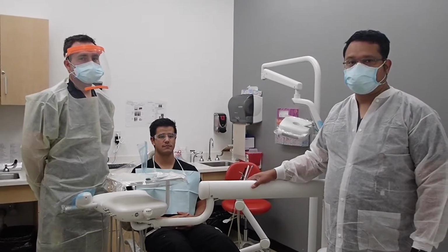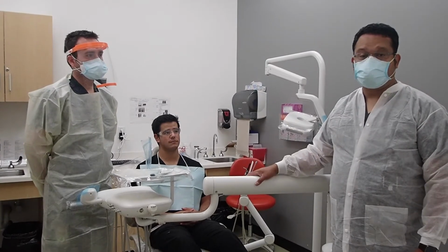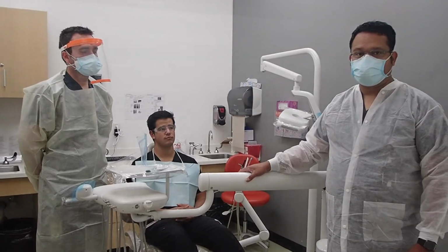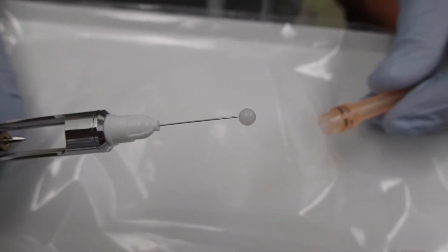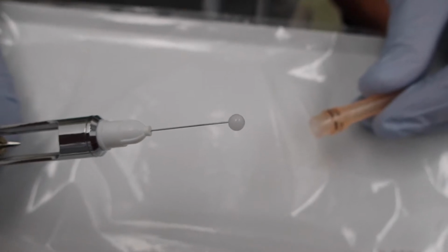Hello, and thank you for joining me for part 2 of today's seminar, where we'll be discussing injection techniques for local anesthesia. Today we have Kevin and Drew with us. For today's demonstrations, we'll be using a safety needle with a ball protector on the tip. This will help us highlight our sites of insertion.